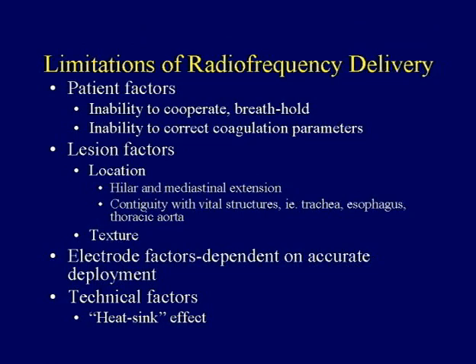Let's talk a little bit about the limitations of radiofrequency heat deposition. It's the energy that's so critical, getting to the 100-degree burn. One of which is patient factors. Anything in the lung is always, I believe, much more complicated than anywhere else. Maybe a small bias. But the ability to cooperate and breath hold is critical, yet you want good conscious sedation on the other side. And that balance between good conscious sedation and the cooperative patient is why many groups have taken to doing full general anesthesia. There are also sometimes these patients who have malignancies, you have clotting profile issues that you cannot rectify, and we will not undertake a procedure if there is any question about that.